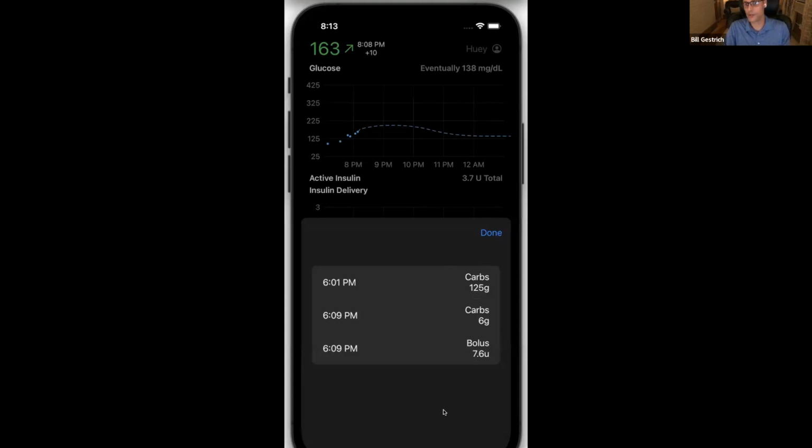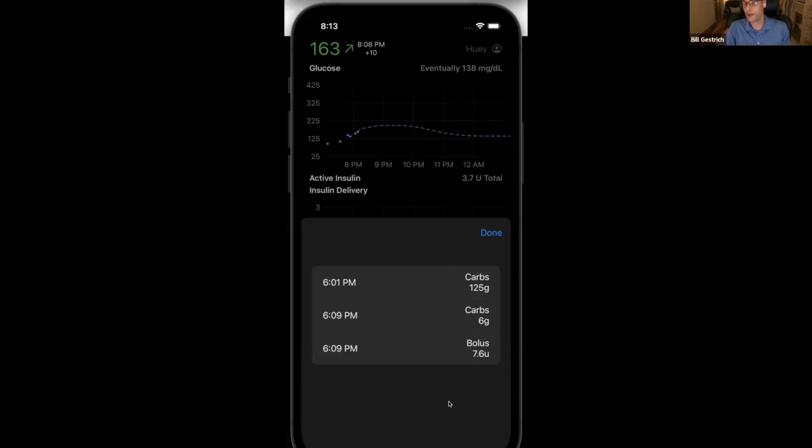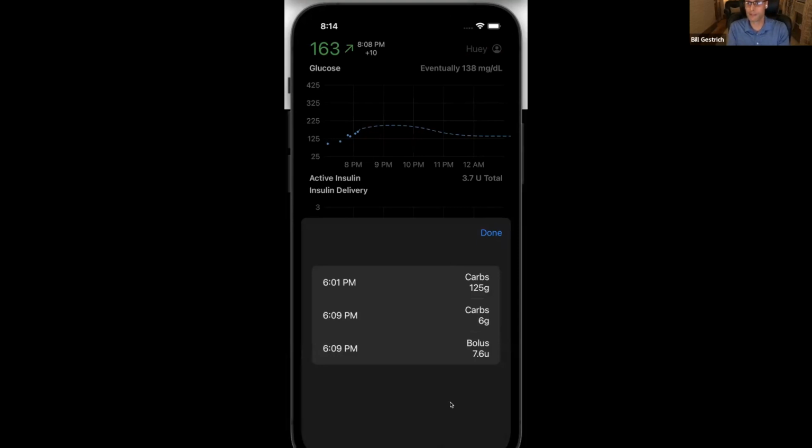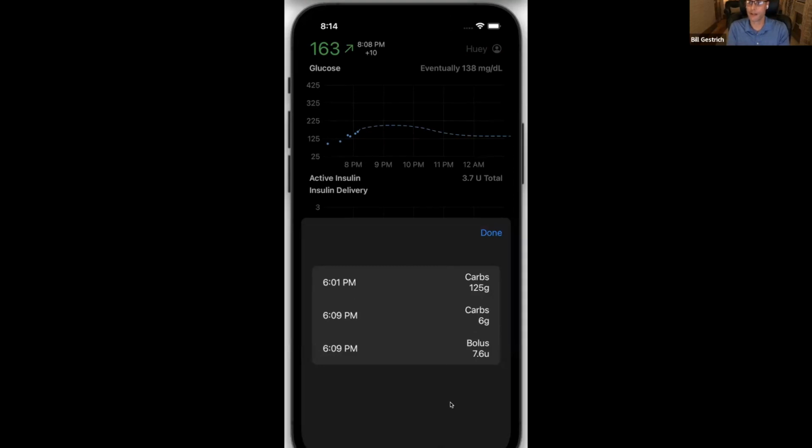Additionally, coming soon, you'll be able to see the errors that occur when somebody attempts to send, say, remote carbs, and there's an error within Loop, say the password expired. We're going to talk about that in a bit. That's going to show up here as well. So for the first time, you'll be able to view errors that occur on the Loop side within Loop Caregiver. That's been a gap we've had in functionality for a while.